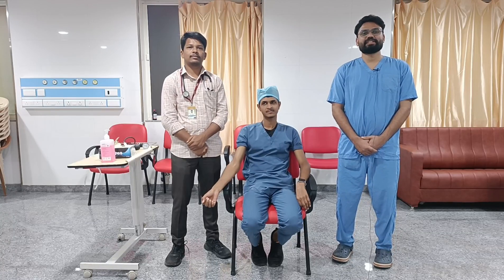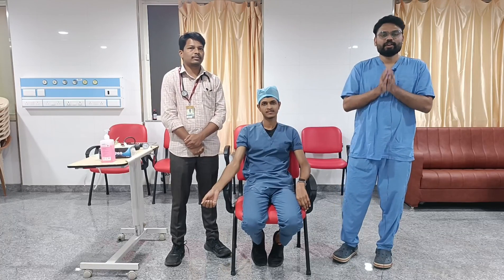Welcome to ATCM, the emergency medicine channel. Today we are going to discuss the basic steps to be followed in measuring blood pressure. There are ideally six steps to be followed in making a proper blood pressure reading.